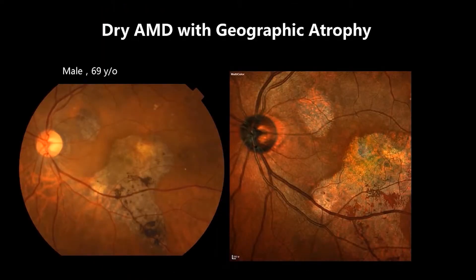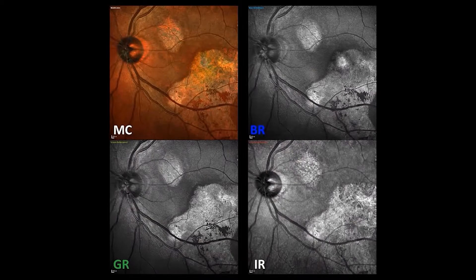In dry AMD with geographic atrophy, multicolor image has its advantage. The area of atrophy was demarcated better than on color fundus photo. Infrared reflectance showed the best detail of RPE atrophy. In blue and green reflectance, as well as multicolor, we can see RPE migrations.